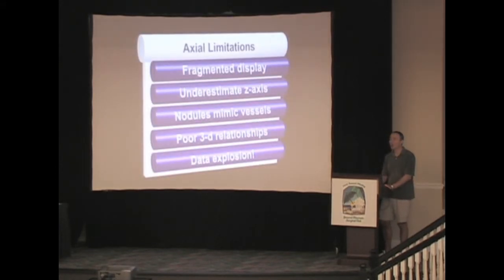So why are we trying to get away from the routine axial display as the only method available? Well, although it's been with us for a while, it's got a lot of problems. Obviously, it fragments the display of complex structures like the airway and pulmonary vasculature.